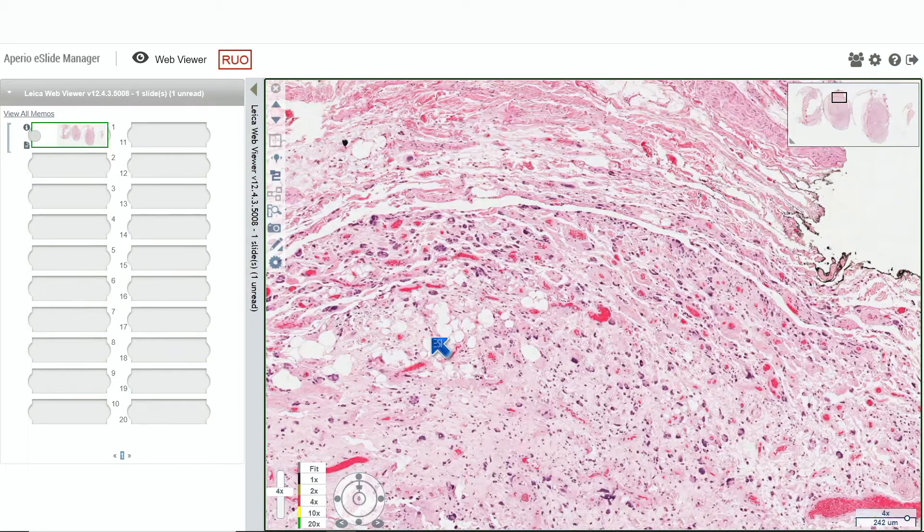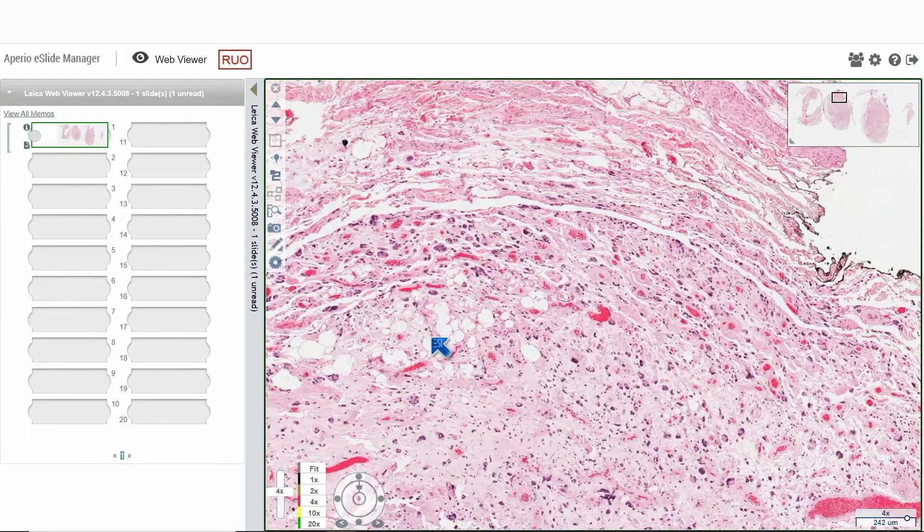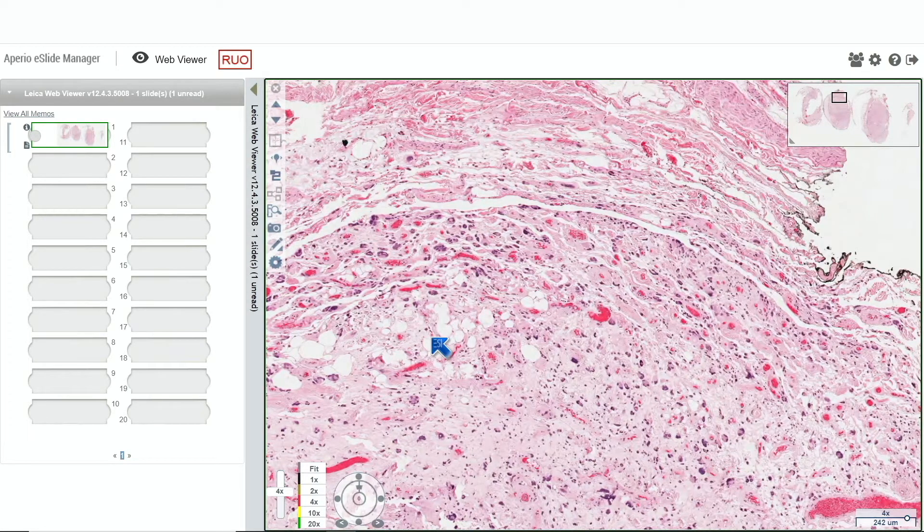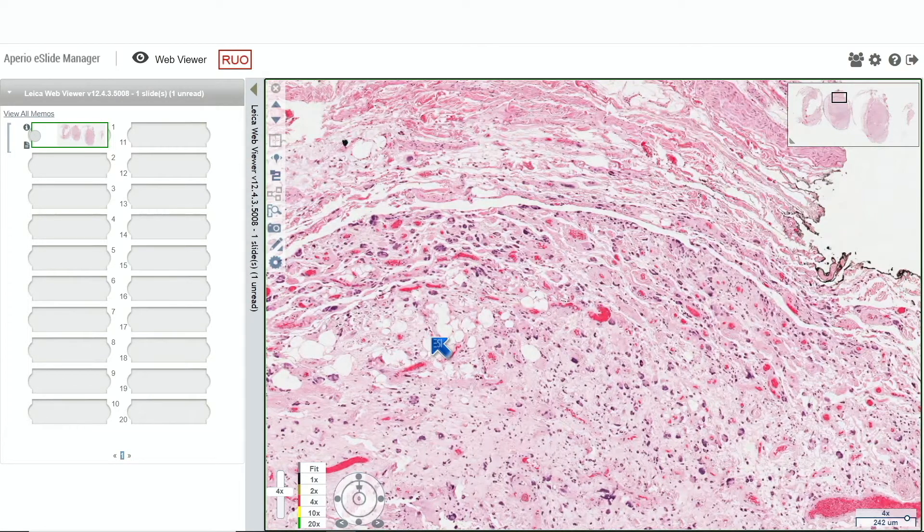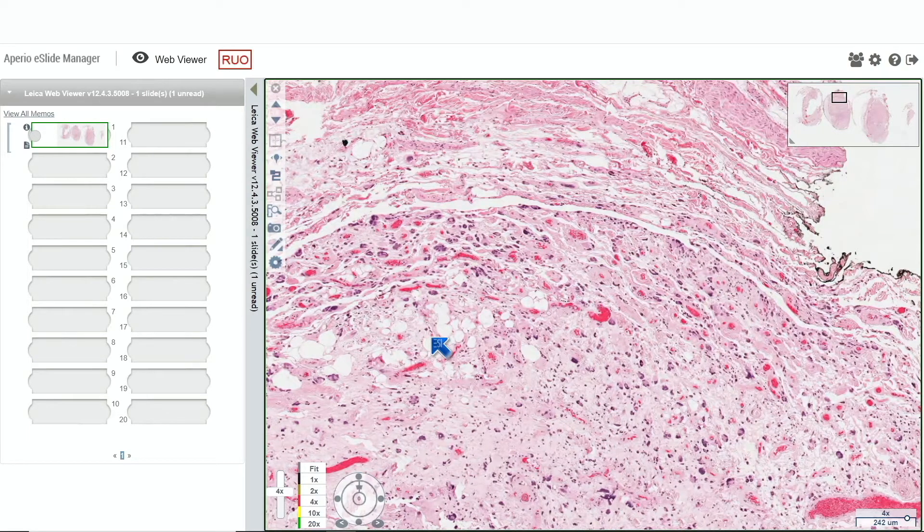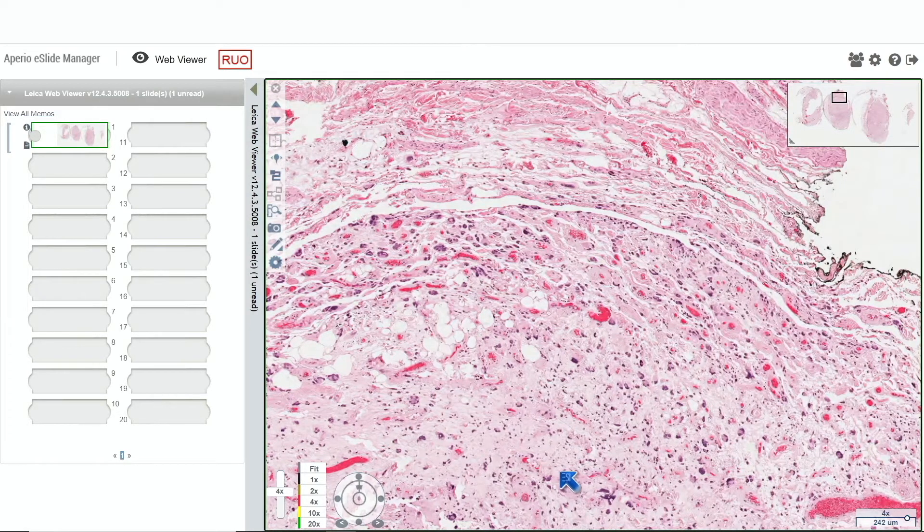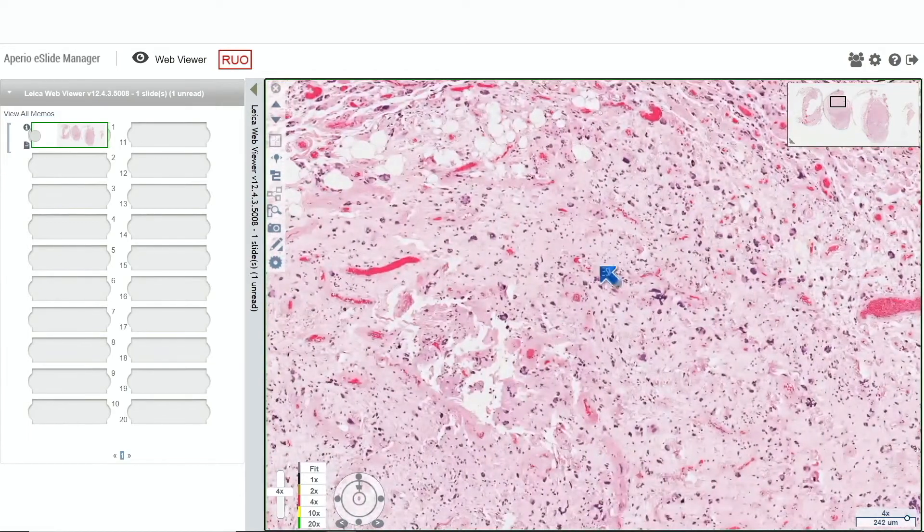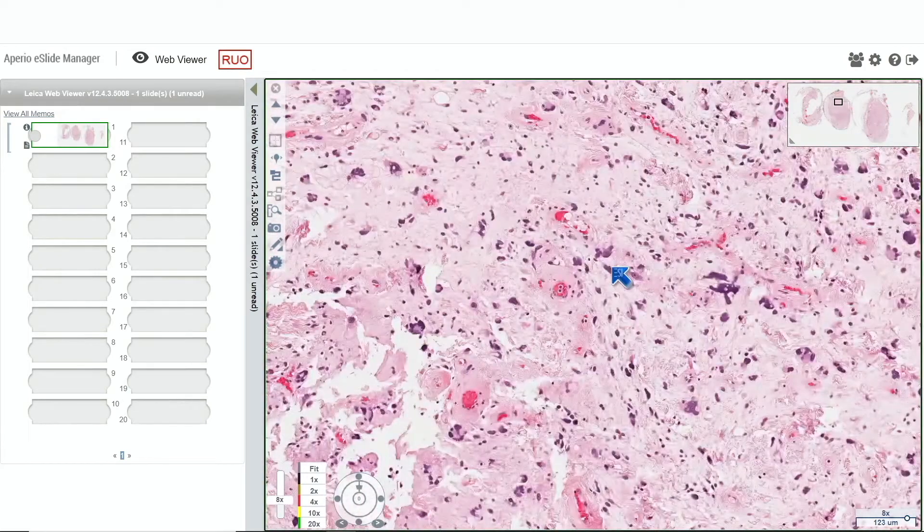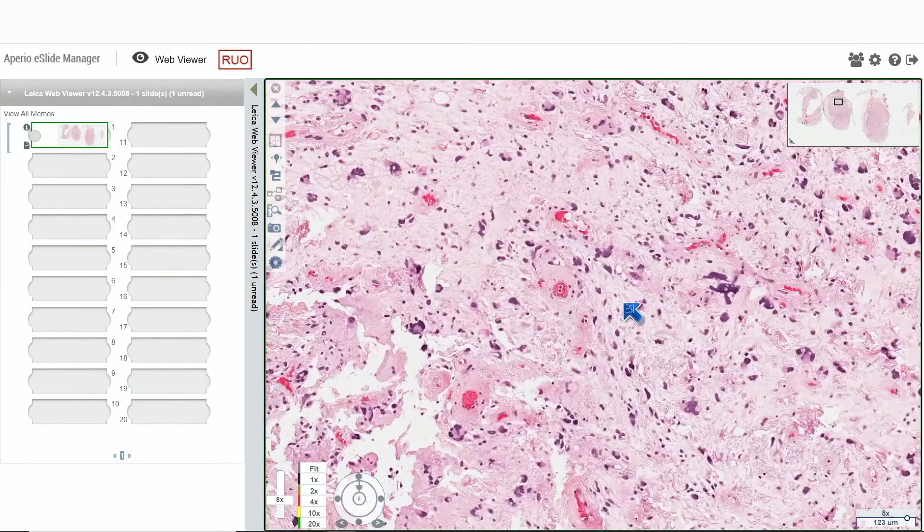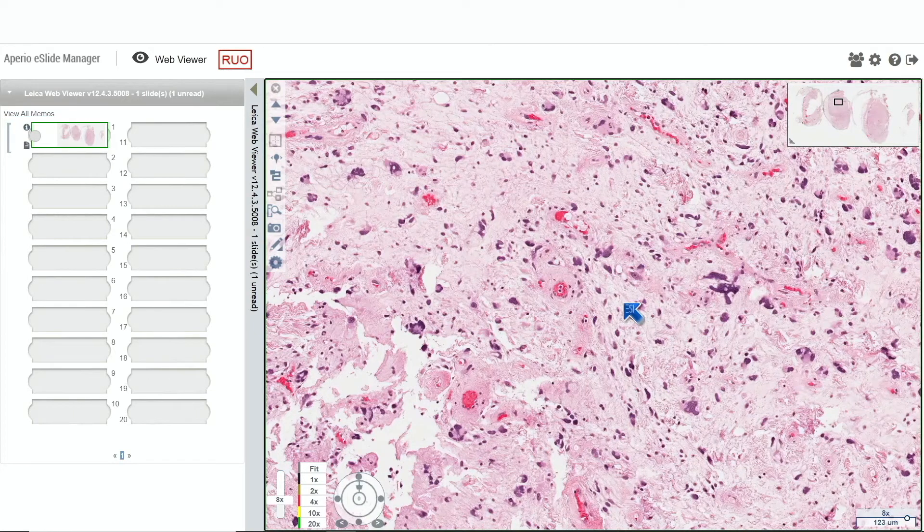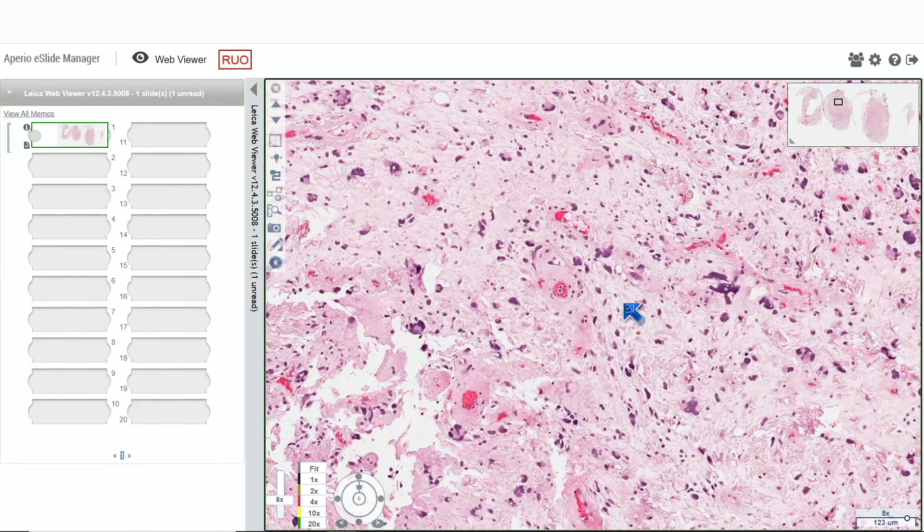That's really well documented. There's a certain percentage of these cases that have no fat because the neoplastic cells, at least in cases like this, are fibroblastic, which is why they stain for CD34. CD34 is a good fibroblastic marker. I just wanted to raise this point that you do have fat-free pleomorphic lipomas. I think it makes the diagnosis harder unless you know this exists.